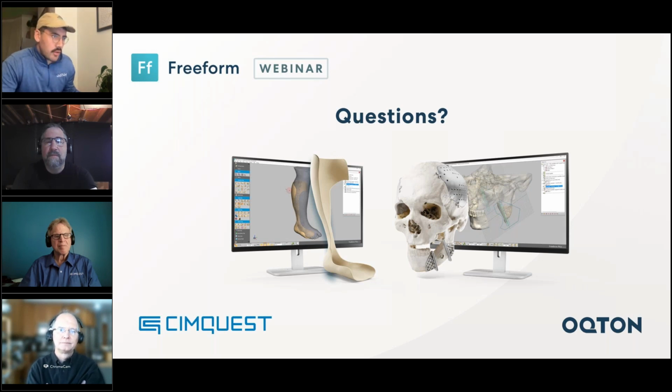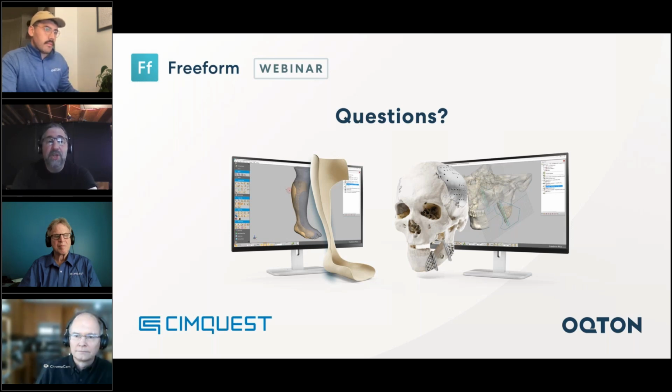There's a number of questions here about the clay model. I think they're best summarized as, can you explain the difference between the mesh data and the clay model within Freeform? Yep, very quickly, our clay is a voxel representation, so it's a closed surface. It is converted and sampled at the resolution that you define. So during the workflow, I changed resolutions a couple of times.